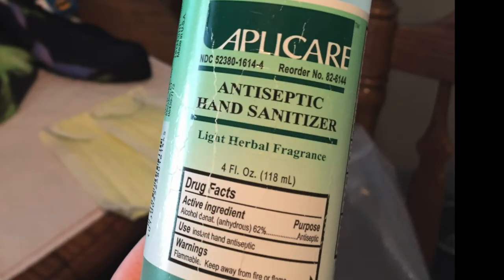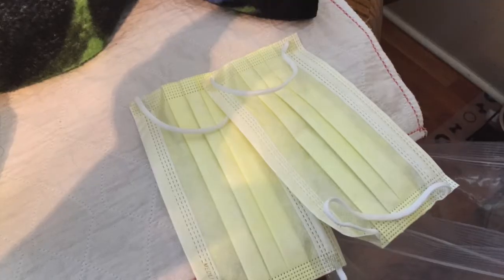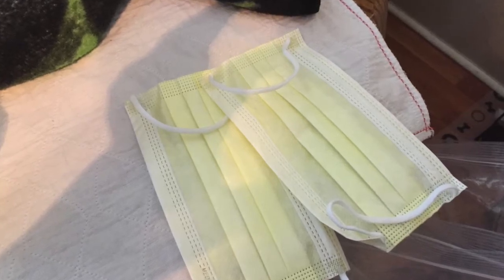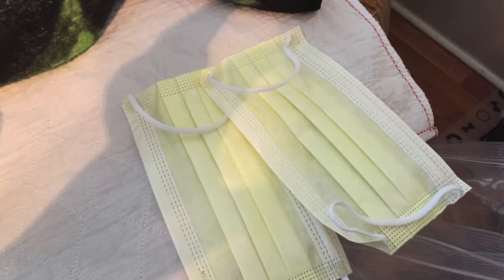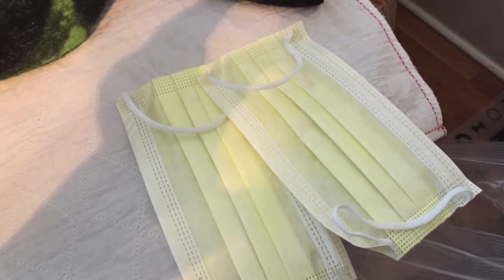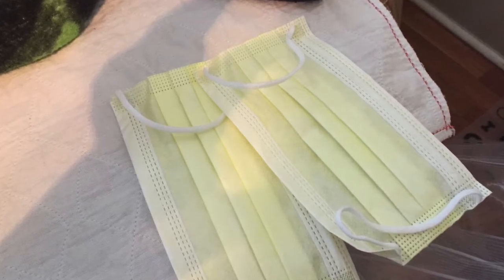First, we have hand sanitizer — this is the hand sanitizer we use, it's a really good sterile hand sanitizer. Everyone needs hand sanitizer to keep things sterile. Next, everybody needs a mask — everyone who is around you when changing a central line, PICC line, or any patch. It keeps everything sterile and leads to fewer infections, because who wants germs and breath on your central line? Like, ew.